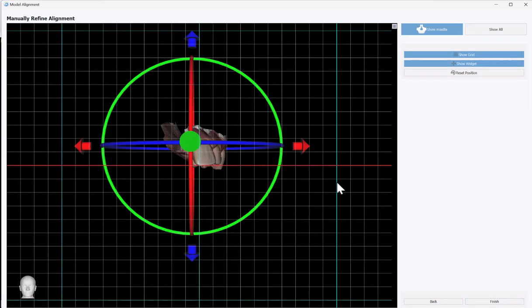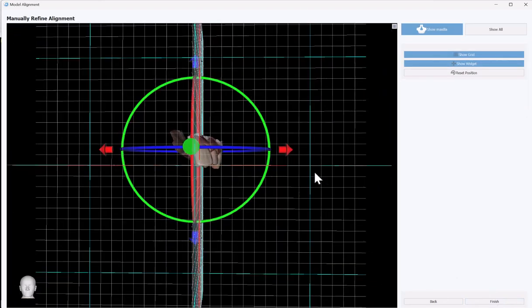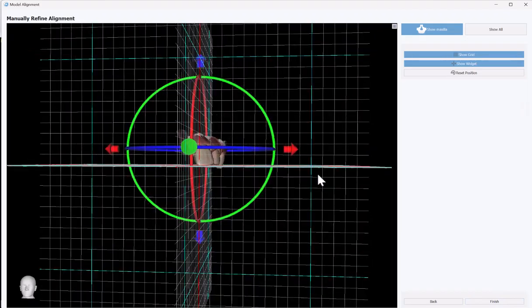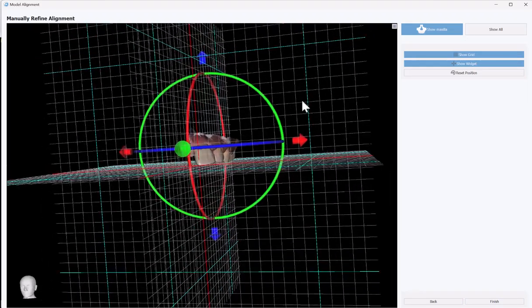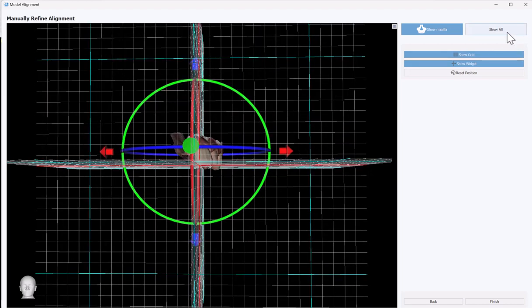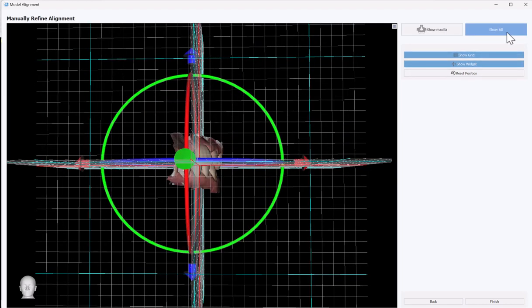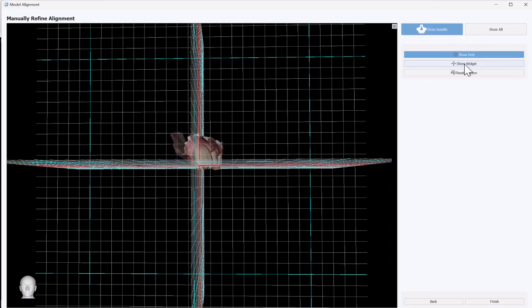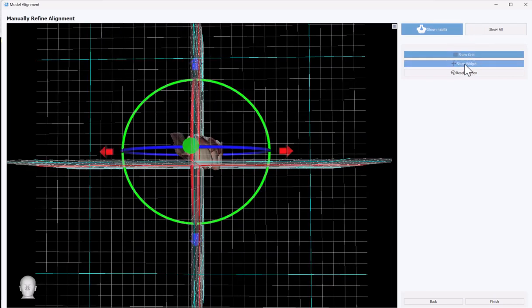Now we are at the stage where you could fine-tune the alignment. If you want to move or rotate or pivot the model in any direction, you could use the on-screen widget. We have the ability to show all models or just show the single model, and you could toggle on and off the grid as well as the widget. Once you've completed the model alignment, go ahead and click on finish.